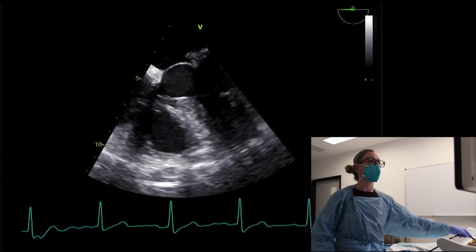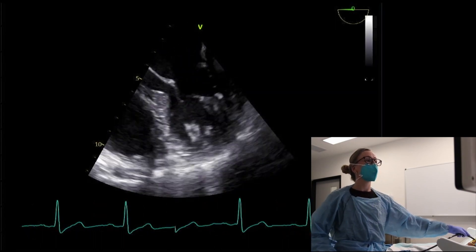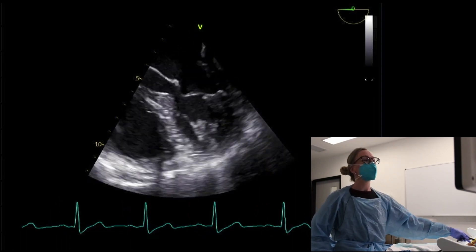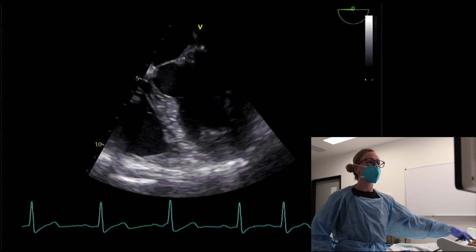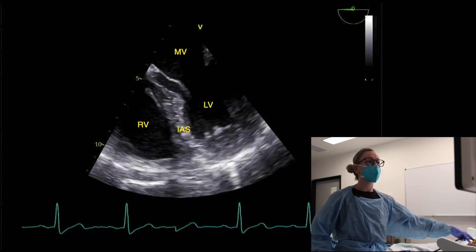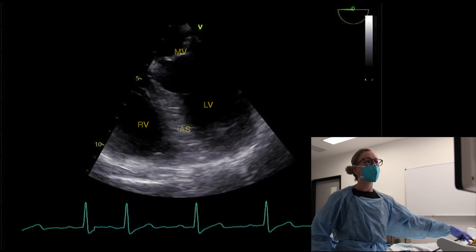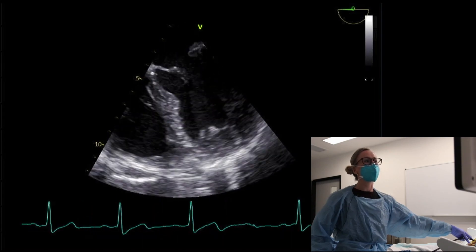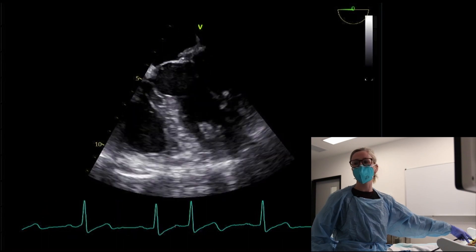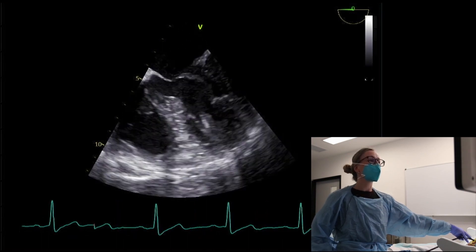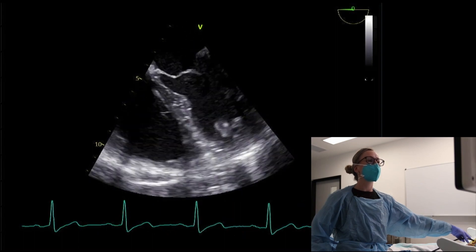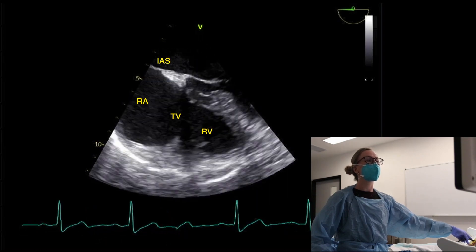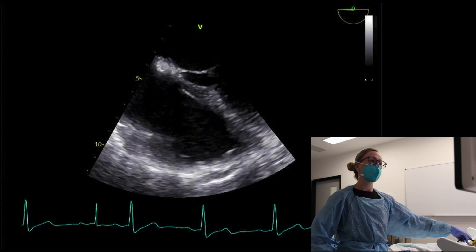We start off at zero degrees in the mid-esophageal four-chamber view, at about 35 centimeters. You can see the left ventricle, the septum, and a bit of the right ventricle. To get a more RV-focused view — we'll ignore the flail mitral leaflet for now — I rotate to the patient's right, which brings the right ventricle, tricuspid valve, and right atrium into view for a nicer look at the RV free wall.